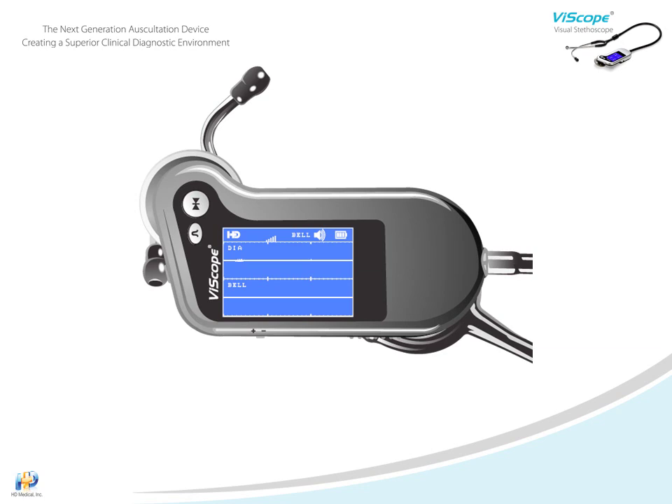Sometimes you want to focus on a particular sound. Changing the gain level will help fine-tune the specific audio you are concentrating on. Using the three-way key, scroll in the direction of the plus sign to increase the signal, and in the direction of the negative sign to decrease the signal.